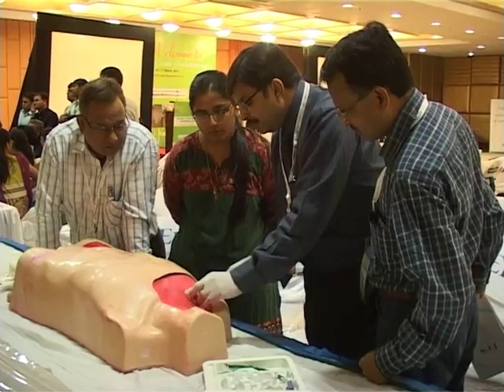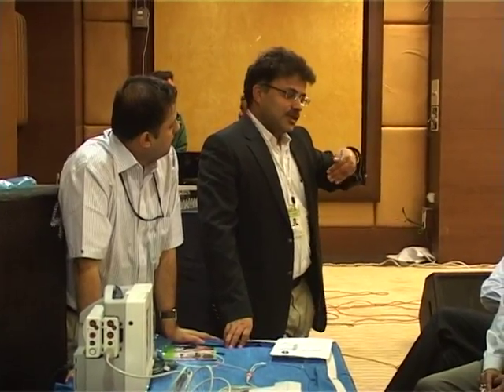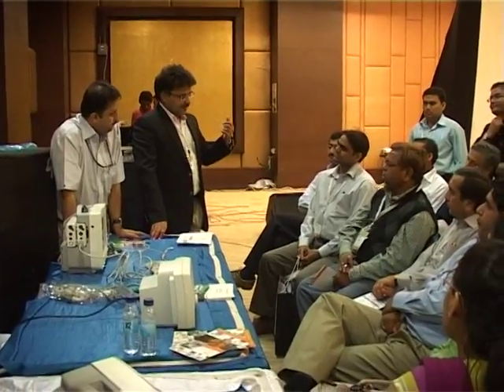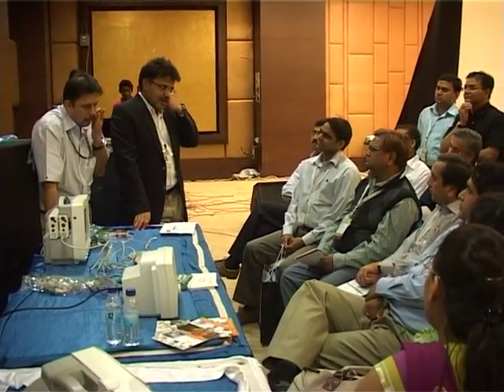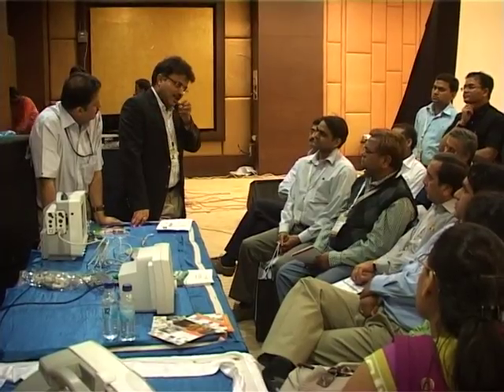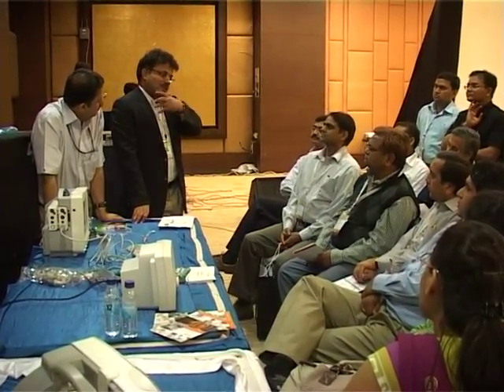Keep things near normal, but not up to normal. So thermodilution, what was being used in the Swan-Ganz: it used the central vein, right atrium, right ventricle and then pulmonary artery. We put it in the central vein, and what was ejected from the right ventricle, the temperature drop, flow and time were used.